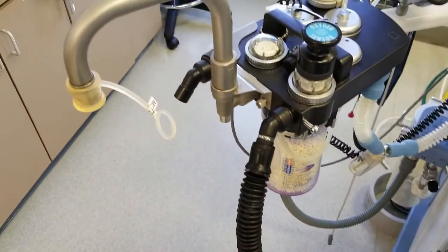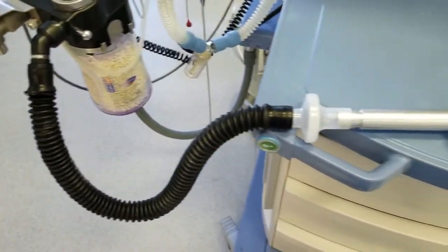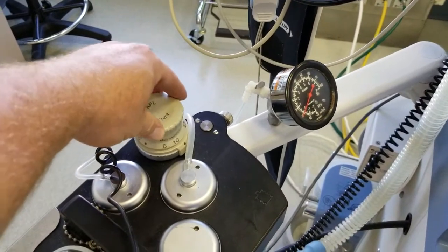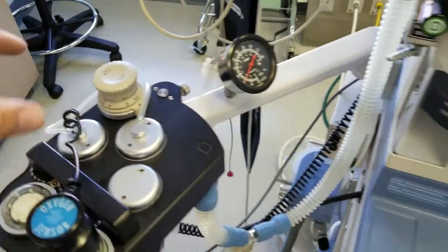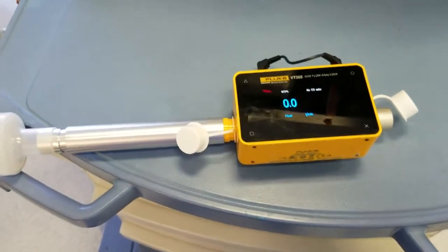The only other thing I did is I plugged the bag mount, so this is going to force all the air through this pipe. I've also turned up the APL valve — anything above zero — and that just forces the air through the VT305 and doesn't let it escape backwards.